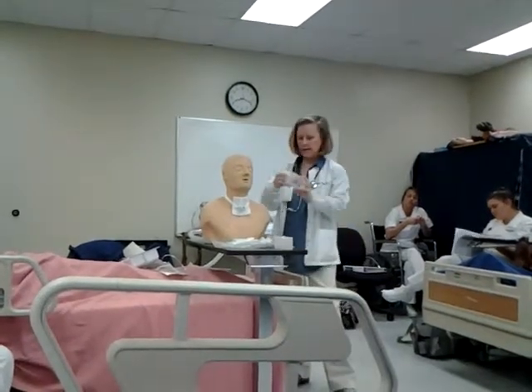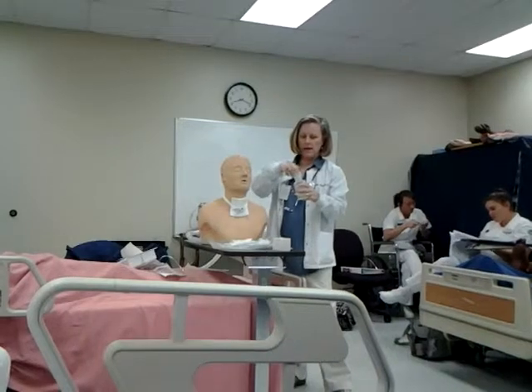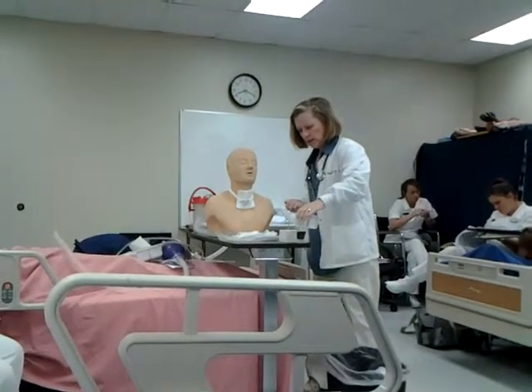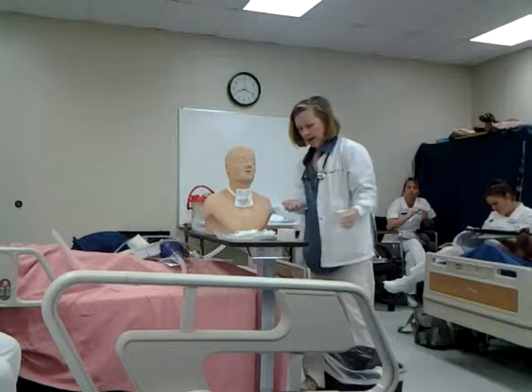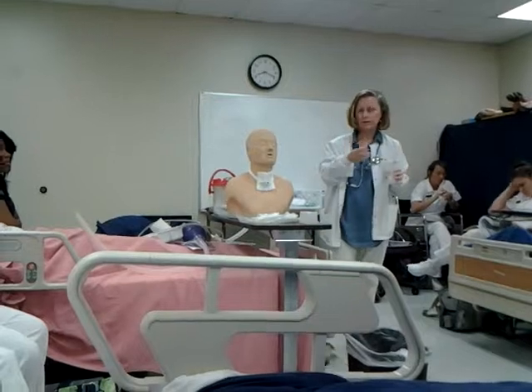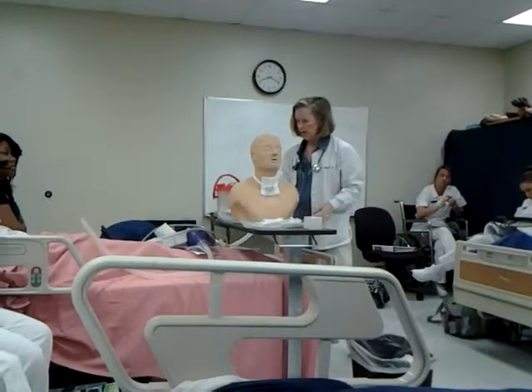So I'm going to take my saline and I'm going to palm the label. Couldn't find a Christmas tree. Found a bigger one. I'm going to lip it. Then, when you pour this in, this makes the liner of the bag collapse. So we have our solution in there. That's going to be for cleaning out our tubing. Because can you imagine that it would get kind of junky?